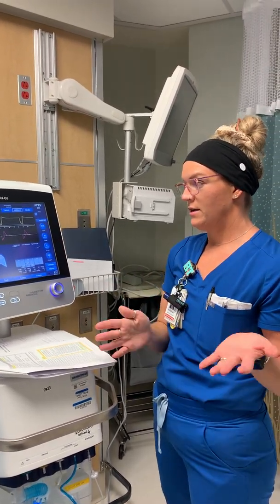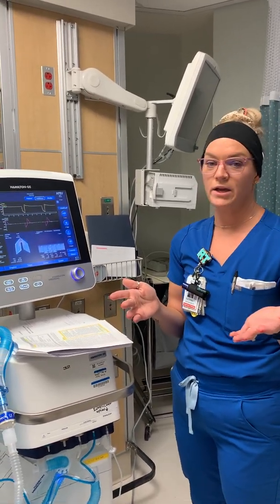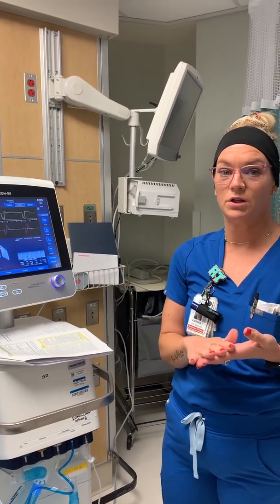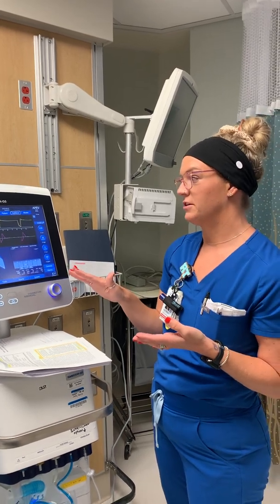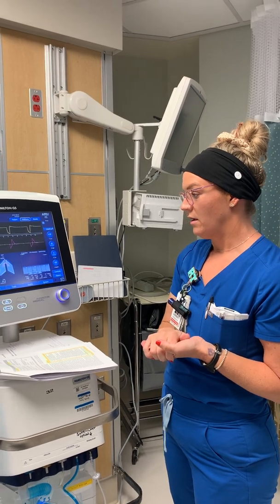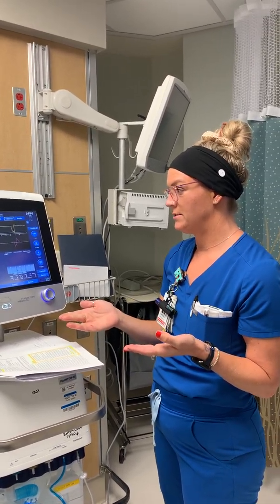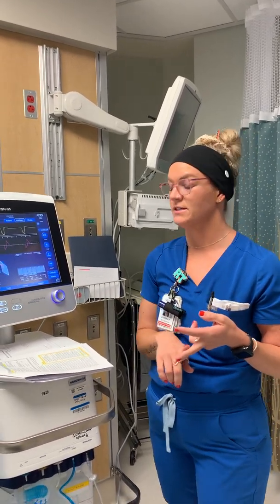One of the main contraindications for APRV is head trauma, because we want CO2 low and don't want to create elevated intracranial pressure. You also probably don't want to use APRV on prone patients, since most will be paralyzed and it's harder to take a spontaneous breath when prone.